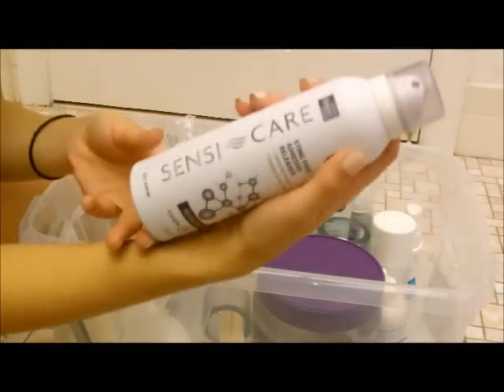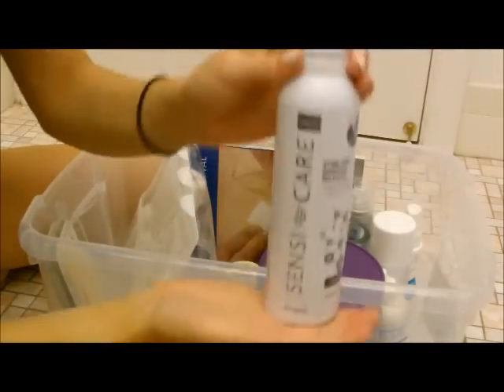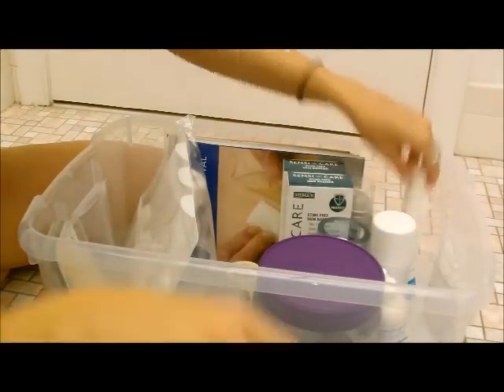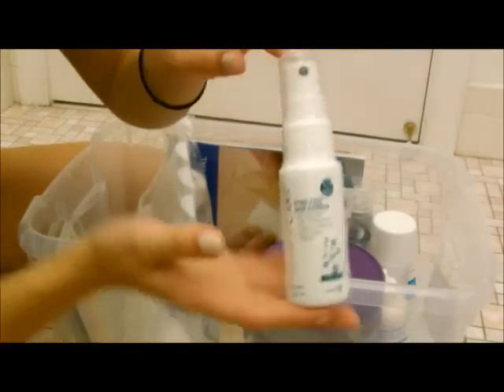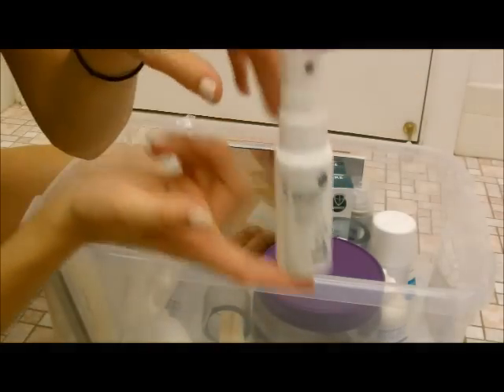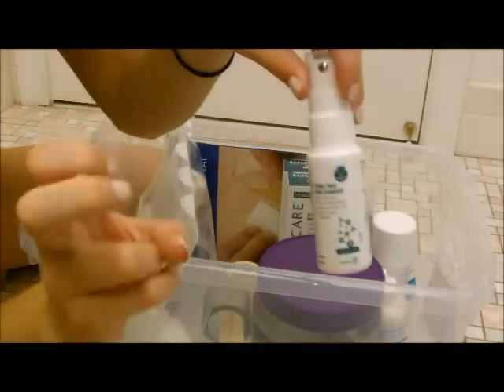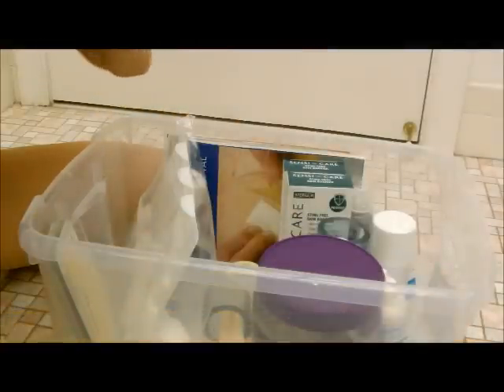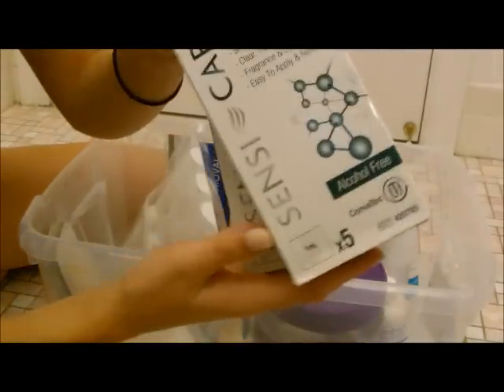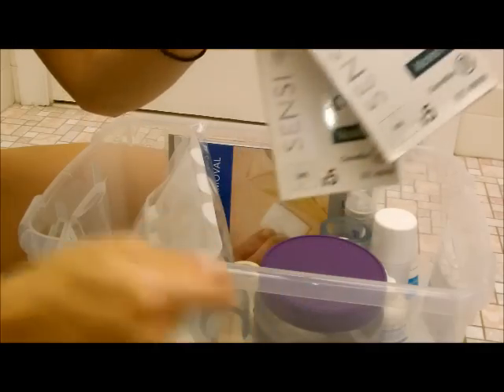I have different sizes of these. I have a giant, look at this thing, a giant sized adhesive releaser spray, and then I have this cute little baby size. Look at how cute. This is the skin barrier, so I think this would be cute to go in a purse or your emergency kit. I love it. And then I also have the skin barriers that come in a stick form, if you know what I'm talking about. You have a little stick so you can wipe it around your ostomy.